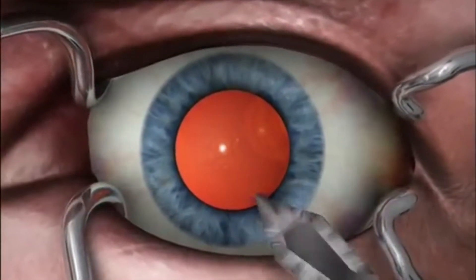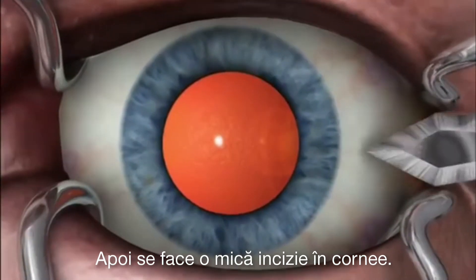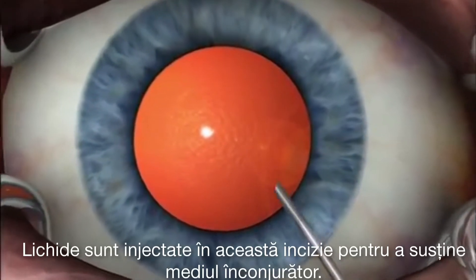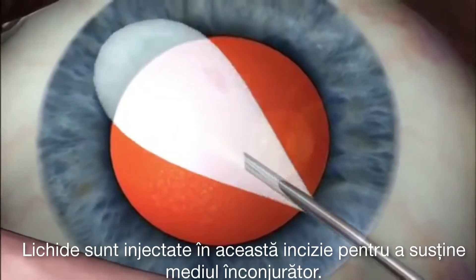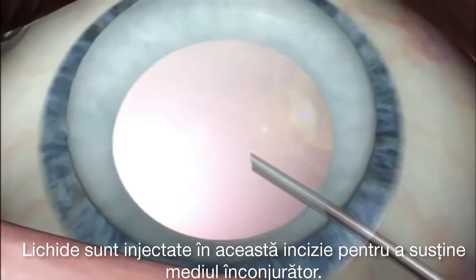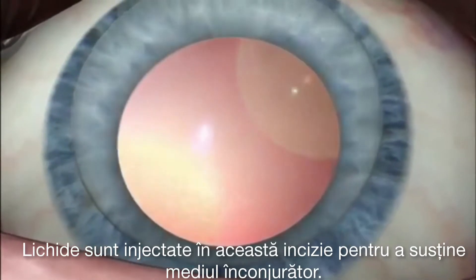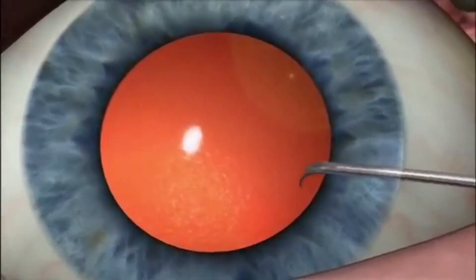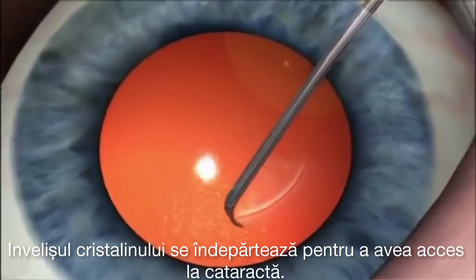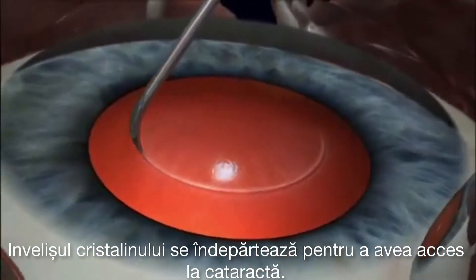Then, a small incision is made in the cornea of the eye. Fluids are injected into this incision to support the surrounding structures. The top of the lens capsule is then removed to gain access to the cataract.